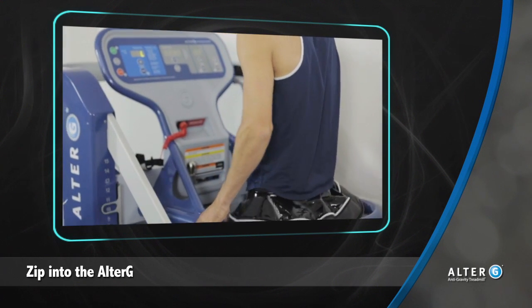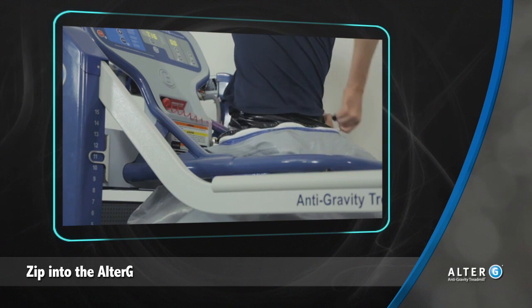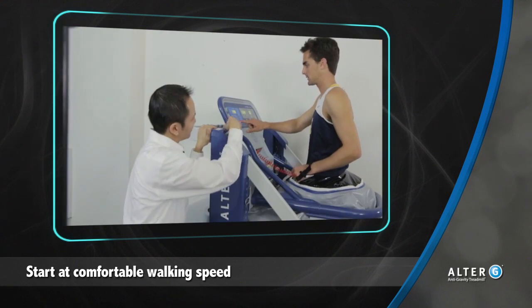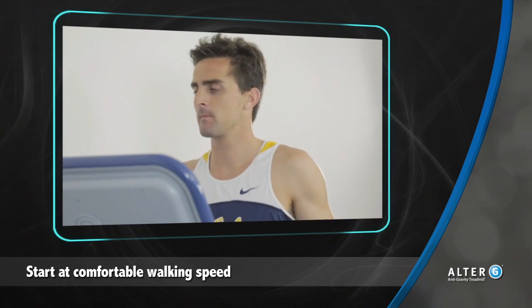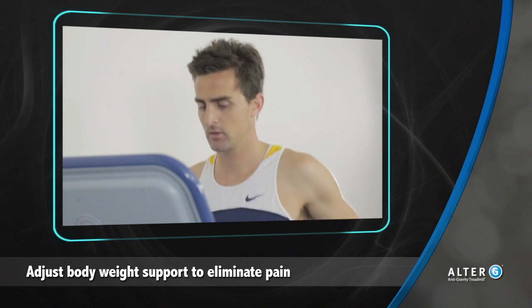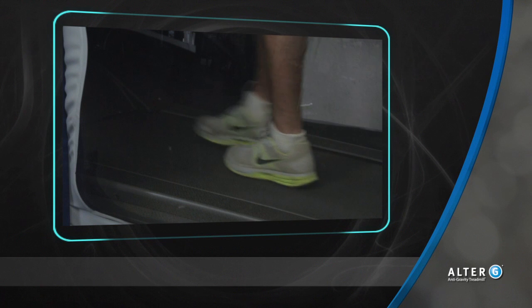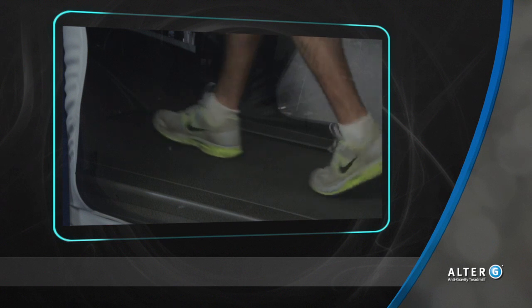Once the patient is zipped into the Alter-G anti-gravity treadmill, they can begin to take advantage of the lower body positive pressure support. Start the treadmill at a comfortable walking speed and adjust body weight support to try to eliminate pain for the patient. As the patient feels less pain, it may be possible to observe a change from an antalgic gait to a more normal pattern. Through the windows of the bag, the therapist can provide feedback to the patient regarding their gait.